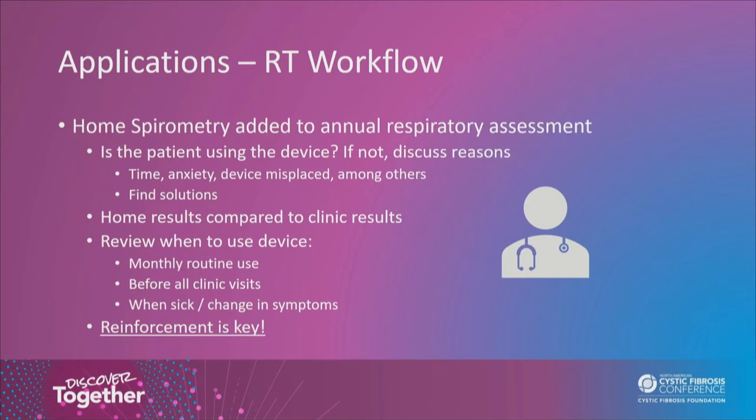Some patients decide not to use the device. We assure them use is not mandatory. This is okay, and we let them know that we're here for support if later on they decide to use it. Lastly, we review when to use the device, encourage monthly use before all clinic visits, and if they're not feeling well. We believe to be successful, reinforcement is key.